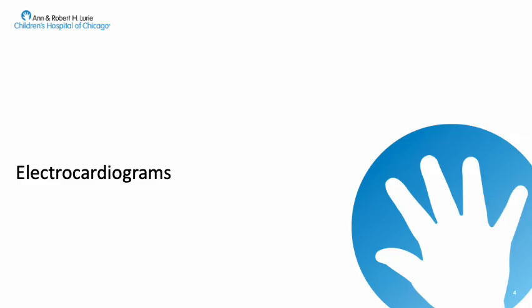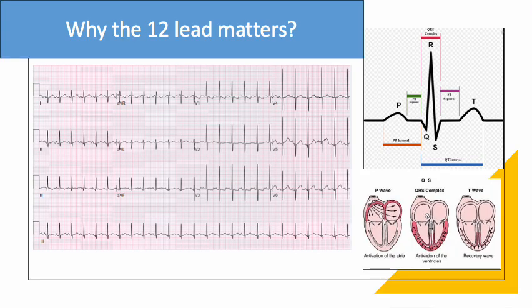Let's review some electrocardiograms. So why does the 12 lead matter? The 12 lead electrocardiogram is the cornerstone for how we as heart rhythm specialists evaluate heart rhythms. We like them both as a baseline and also when people are in tachycardia because it allows us to compare a lot of different things. You all look at a fair few ECGs on newborns and neonates, so you're going to feel fairly comfortable evaluating the average 12 lead on a newborn.